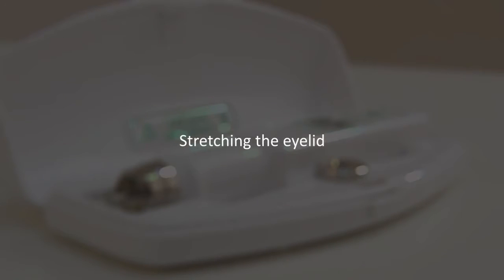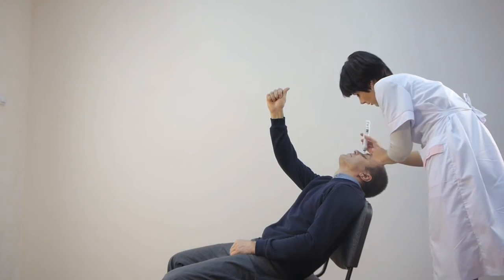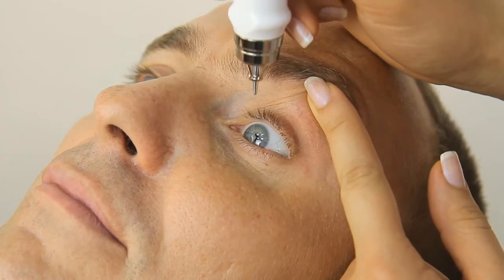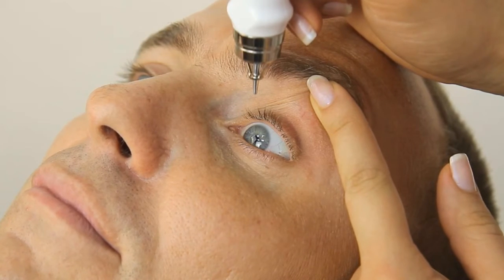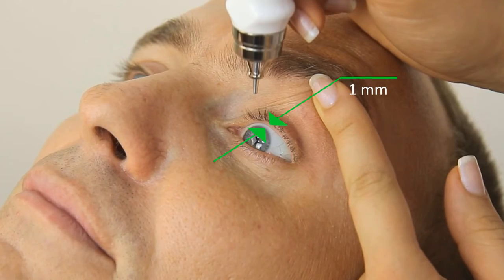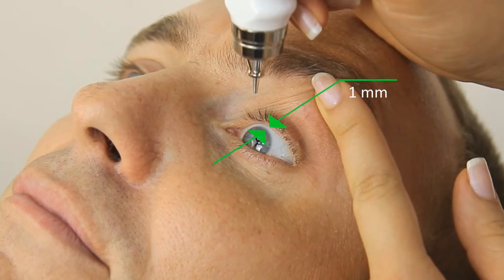Stretching the eyelid. Stretch the upper eyelid of the patient's left eye with the index finger of your free hand, but do not press on the eyeball. The edge of the upper eyelid should be slightly above the limbus, showing a narrow strip of sclera between the edges of the limbus and eyelid. Hold the eyelid in this position during measurement.